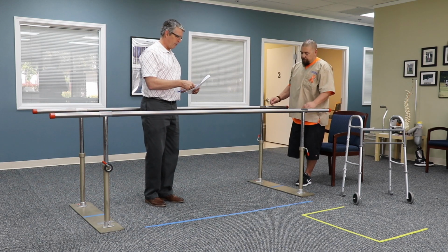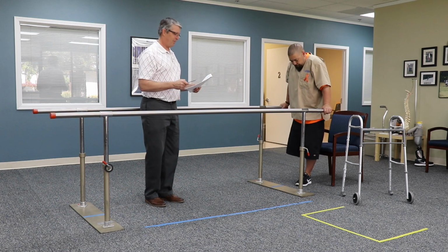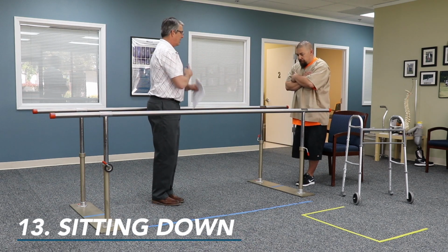The first attempt, he performed it independently without help or assistive device. I would put him at a 2. So sitting down is number 13. I want your patient to cross their arms and sit down in the chair.